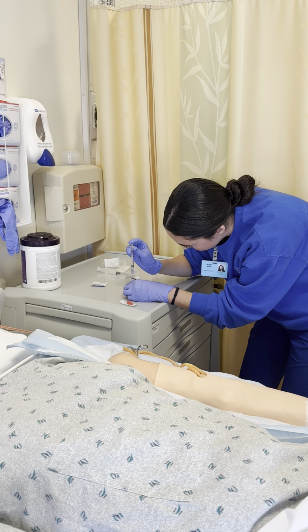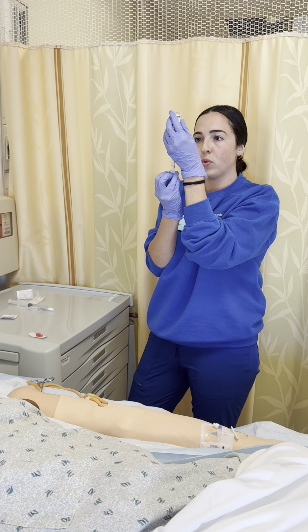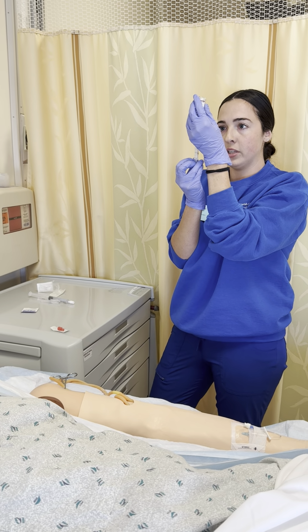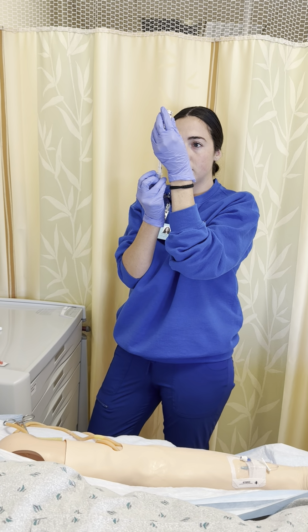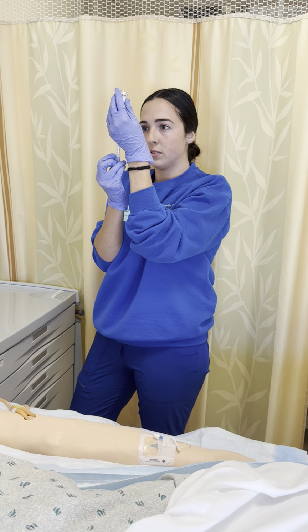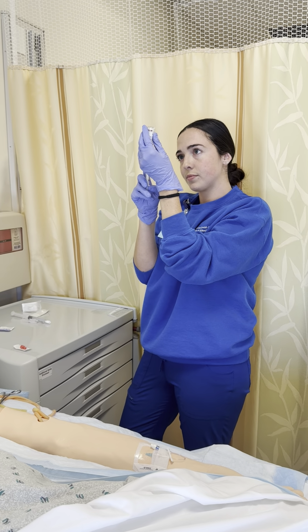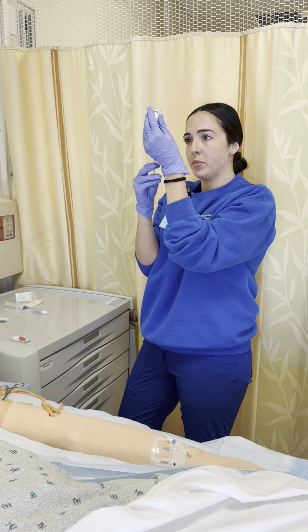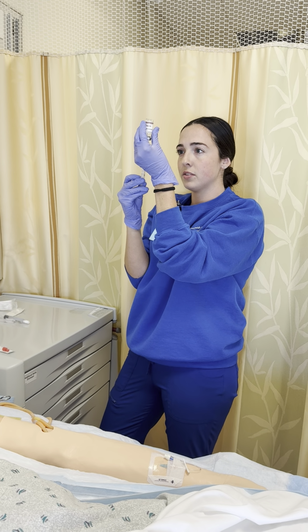Great. I'm going to advance further, and I'm going to go right up and down, and I'm going to pull 1 milliliter of liquid. I'm being sure to get rid of any air bubbles that I may have.